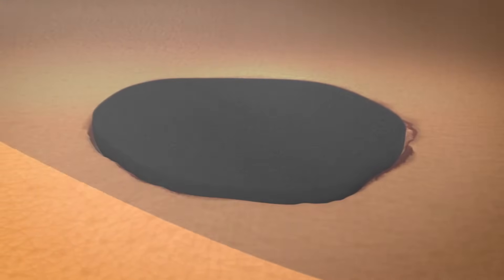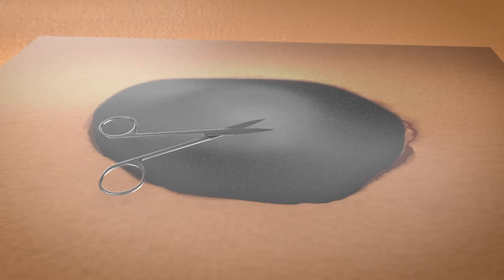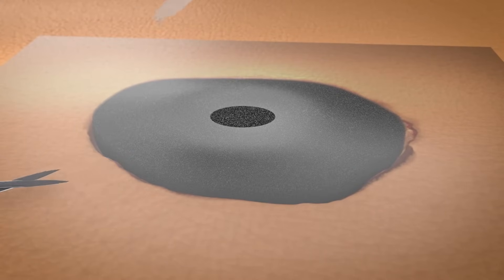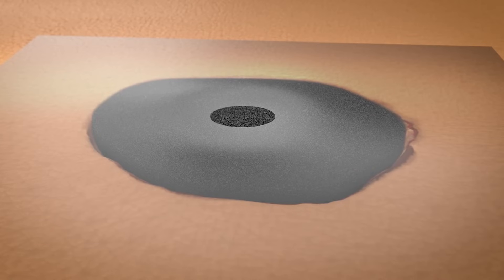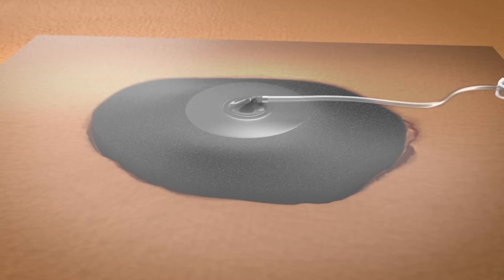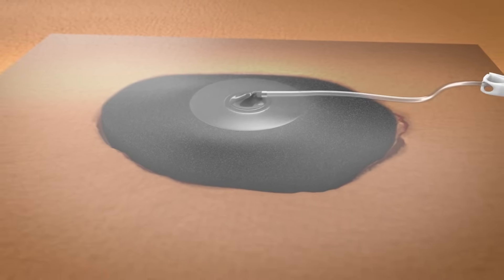A semi-permeable drape is then used to seal the wound, provide a moist wound environment, and protect the wound from external contamination. The proprietary 3M sensor track pad and tubing are then applied to the drape and provide the connection to the therapy unit.